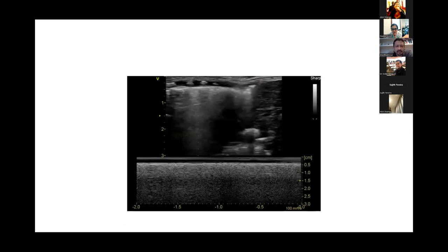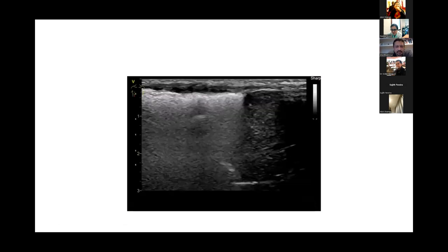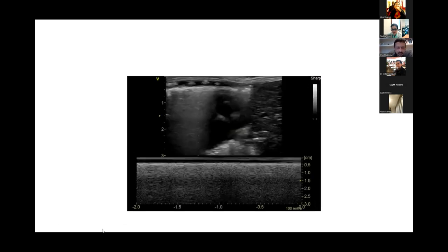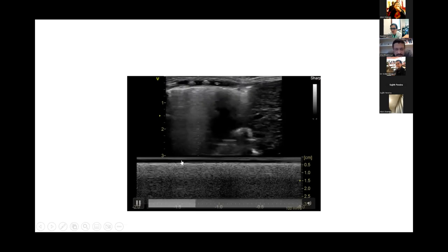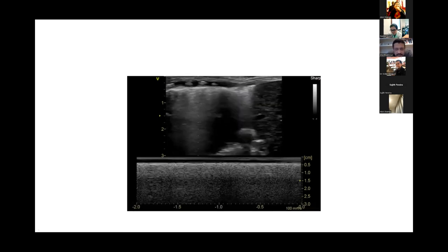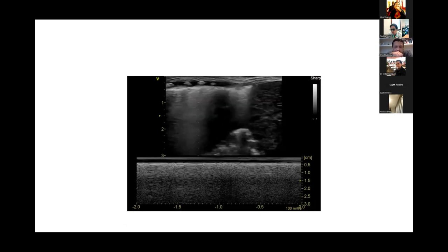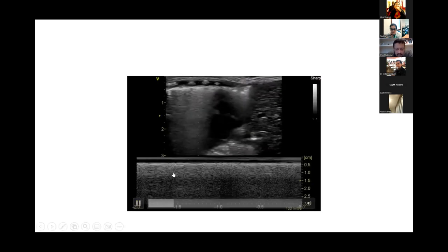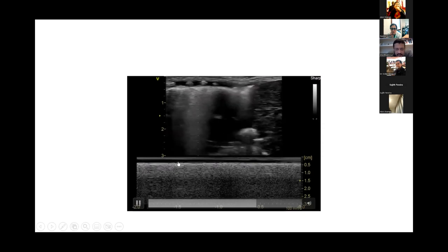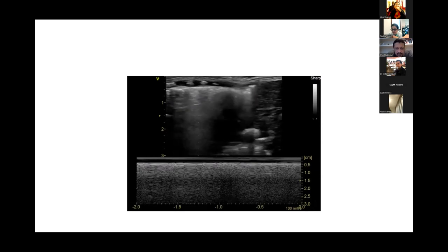If all your screen had been black with these parallel lines, that would have been a barcode or stratosphere sign. But you have a difference between the upper part of the screen, which is not sliding, with the subcutaneous tissue and the ribs. Whatever, you've got the heart, which is giving a little bit of pulse and a little bit of sliding, but you've got movement. If there had not been lung sliding in this area, you would have had these parallel lines all the way down. You have a very small area where you have no sliding, because of the way you've set the depth. But if this area where you have the pointer now had gone all the way down the screen, then that would have been absence of sliding.